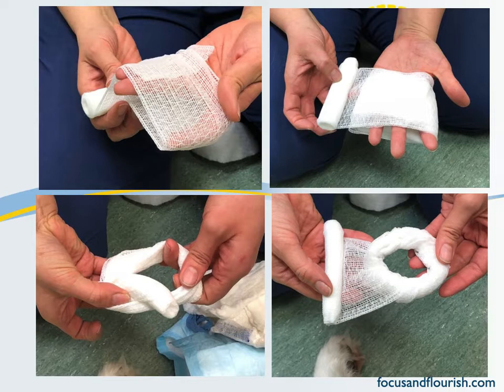Create it to the thickness that you feel you need for your patient. Once it's thick enough you can stop. You don't have to tie it off or anything — just let it be. It's going to live inside the bandage.